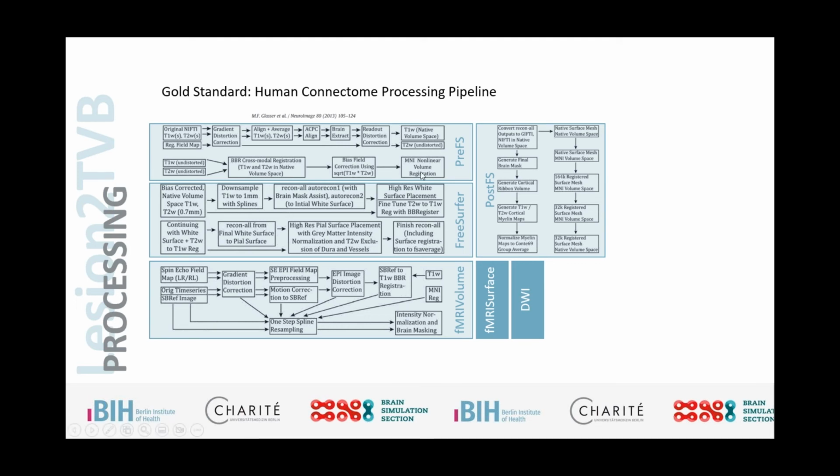And then while we're going through even the surface extraction, we're taking more and more information that we have about the brain. And if we already extracted the surface, then we know exactly where the brain is and what is CSF and what is skull, so we can update our initial brain extraction, etc., so that we end up with the highest quality processed data that we want to have in the end.